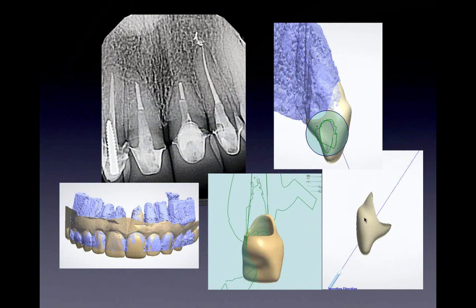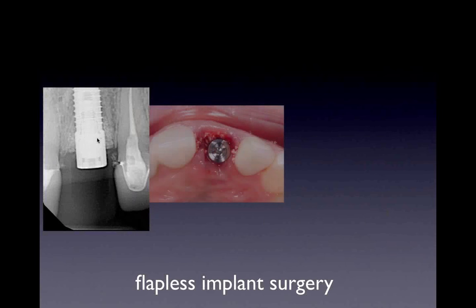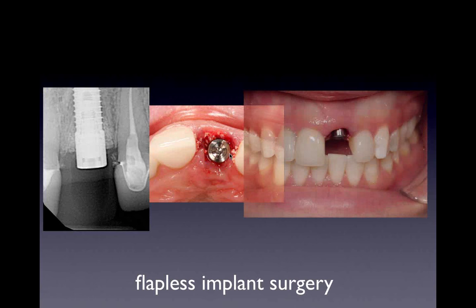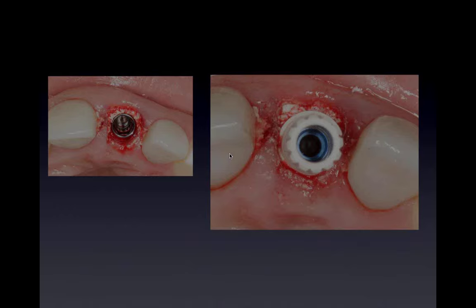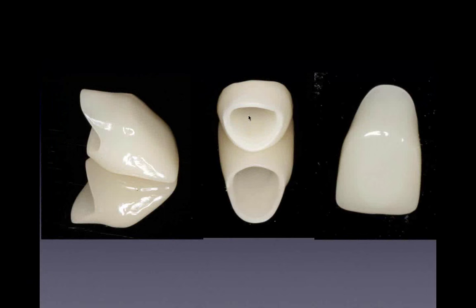Once we get that in position, the surgeon takes out the tooth, places the implant, and you see here the implant, so the patient comes right to our office. Look at the delineation of where the tooth used to be, right? So just remember that shape. What we're doing with our technique is we're using that provisional, putting on a temporary abutment, contouring it down so it's out of occlusion, and opening up and hollowing this little hole here. This is a provisional made out of a PMMA material, made by the laboratory.